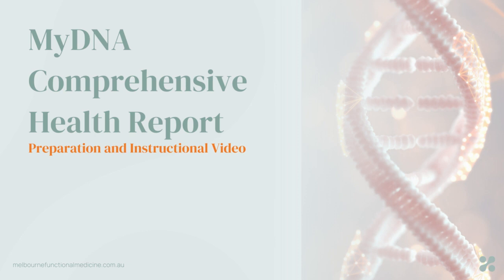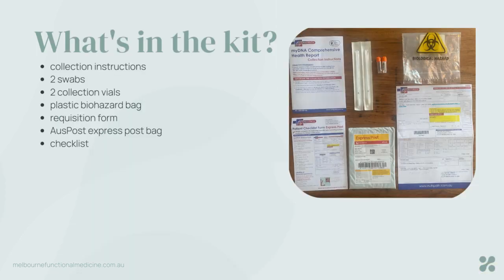Looking at your kit you will find some collection instructions. Even though we're talking through this in the video, please take a moment and read through so that you completely understand all of the things that you need to do to prepare yourself and to actually perform this test. There are two swabs, two little collection vials with orange lids, and a plastic biohazard bag in which your samples will go once you've collected.